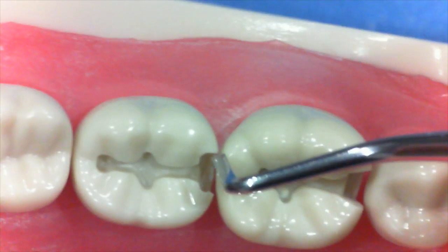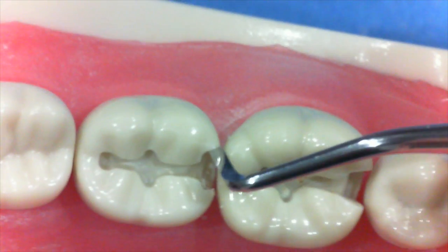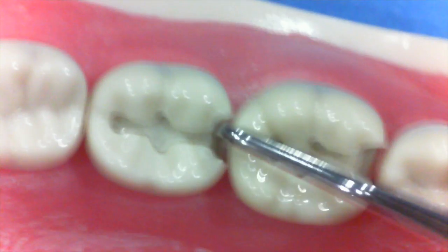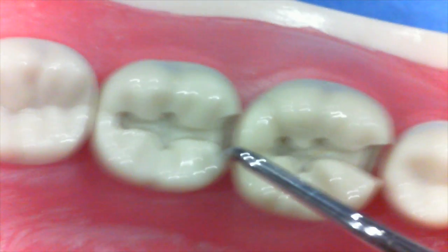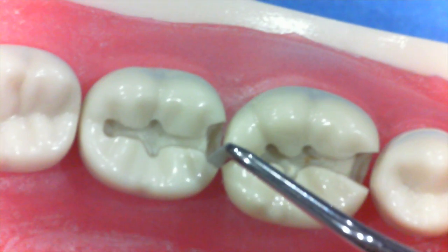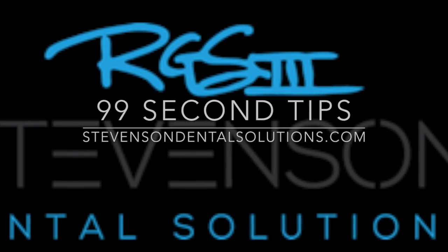Don't twist it, but hold it straight up and down. Usually a couple of strokes is all that's required to get the extension. You want to repeat this same move on the other wall, getting the 90 degree extension while increasing the clearance with the adjacent tooth. Pretty straightforward — a few more steps and we should be done. Excellence is achieved in small, focused steps.